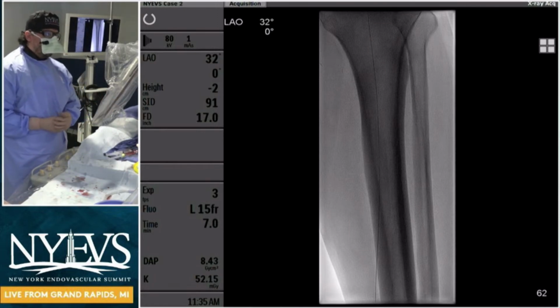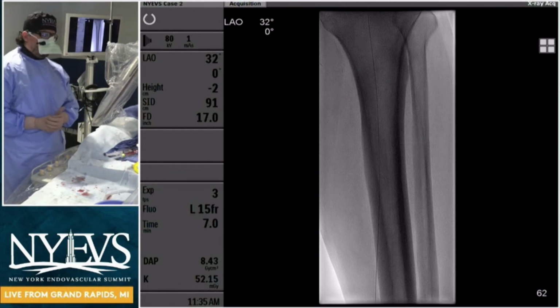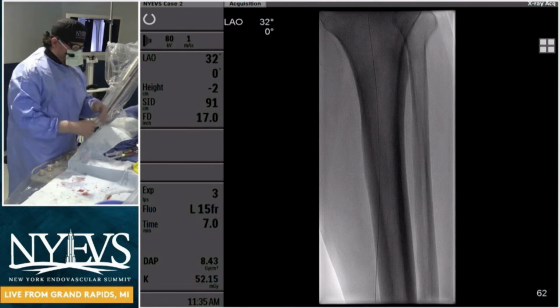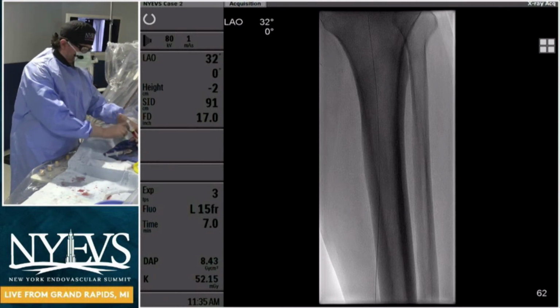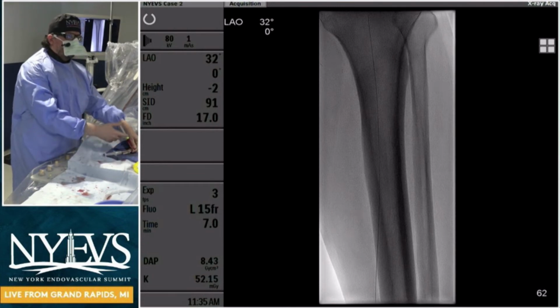But in my opinion, it will make a big difference when you use it in 3.5 versus 2.5 millimeter vessels, like Brian and I say. So I don't disagree with your statement. Now, anecdotally, I think there's a big benefit, but having a larger trial will definitely be beneficial.